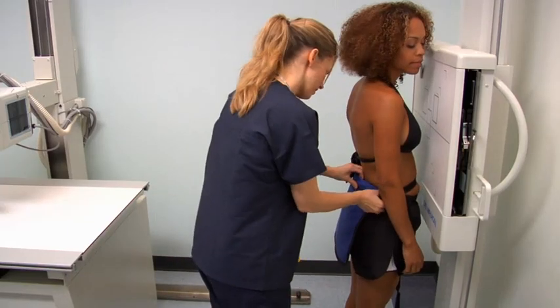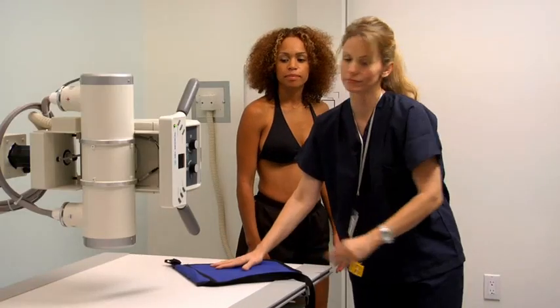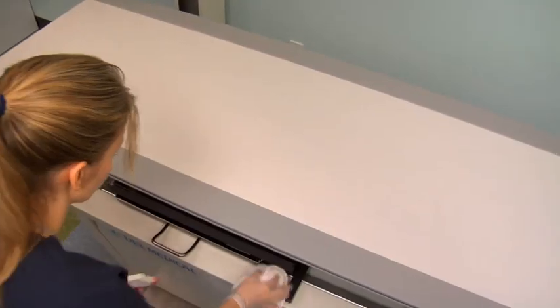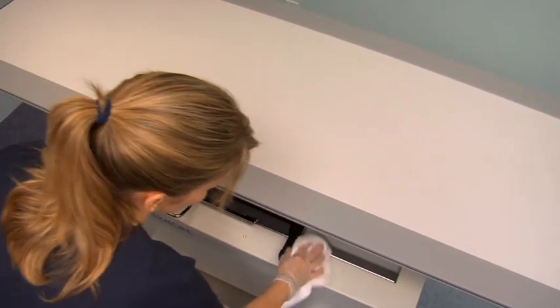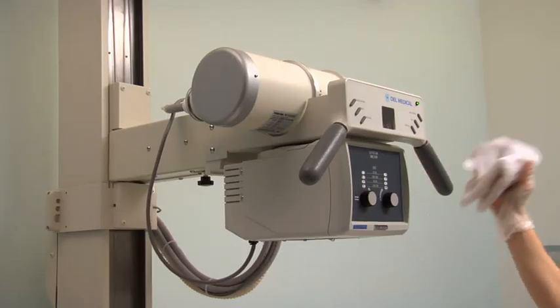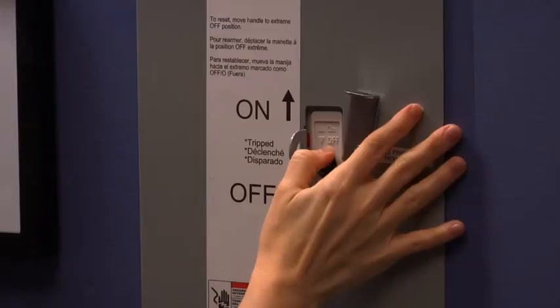At the end of the procedure, advise the patient that they will receive the results of the radiographic examination from their referring physician. Take the patient to a changing room to get dressed, and then escort them out of the radiology department. Wipe down with disinfectant all surfaces, including handles of the cassette, Bucky, X-ray tube, and collimator. At the end of the day, shut down the X-ray equipment and computer system.